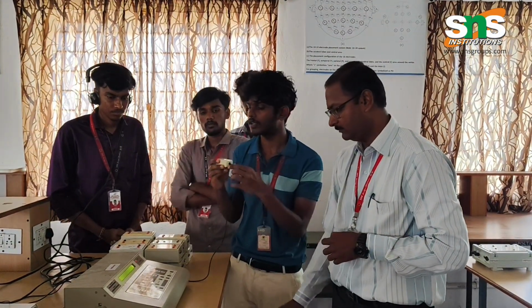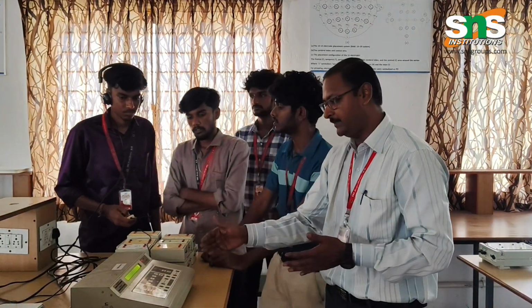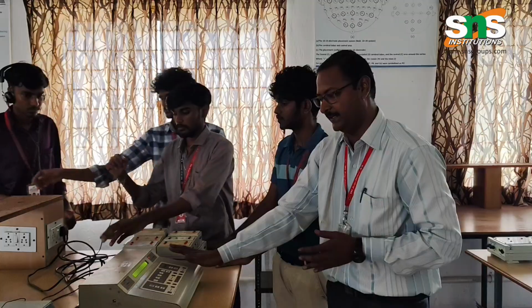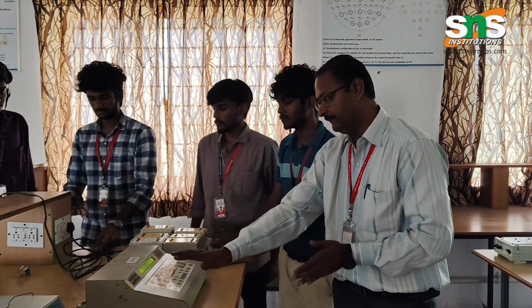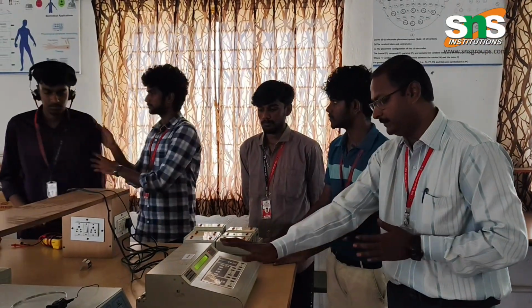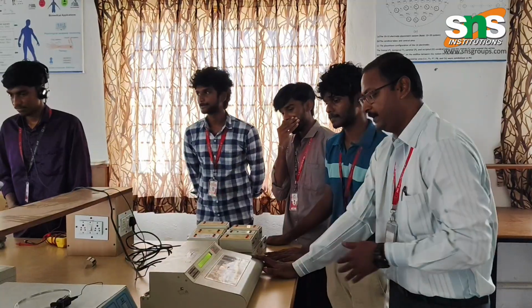And now we are giving this to the patient. The patient has been isolated from the machine, so the patient is not able to see the information we are feeding in here. The decibel level, the frequency, and whether the sound is given to the left or right cannot be seen from this machine. So the patient has been isolated.